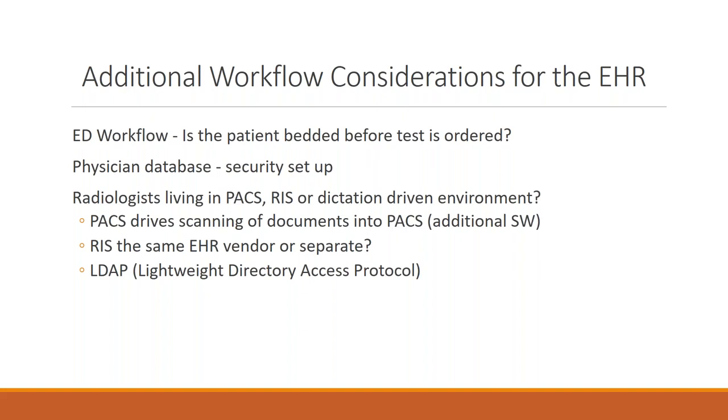Physician databases and security setups. Is your radiologist living in a PACS or RIS dictation world? What is their primary piece? Because that's the workflow. Do they open and sit in PACS and that's what they go from, or do they open in the dictation first and select their images from the dictation system, which is integrated with the PACS? You need to know where that workflow is, because it's a difference in how you set things up.